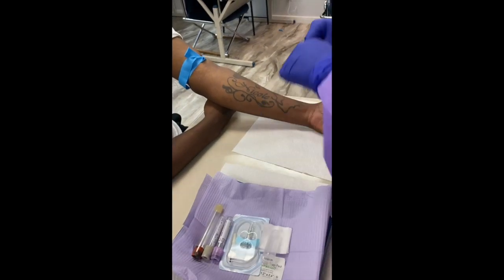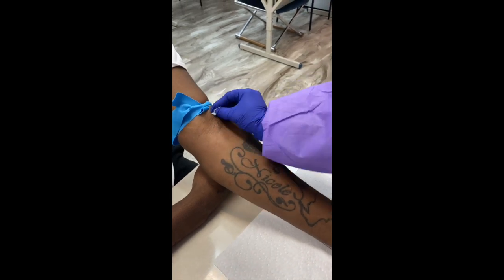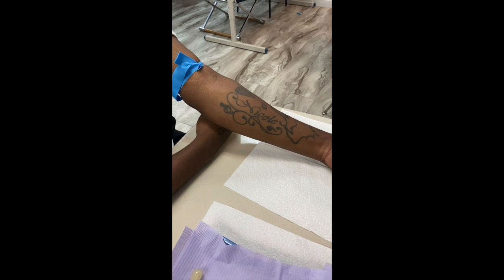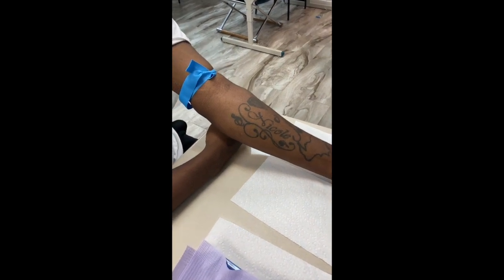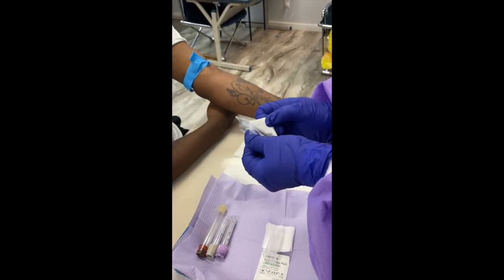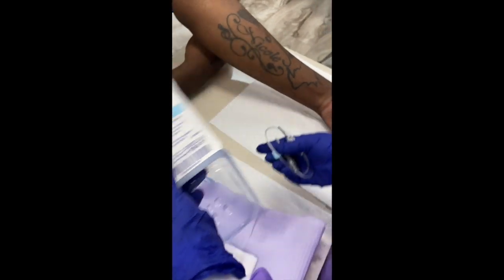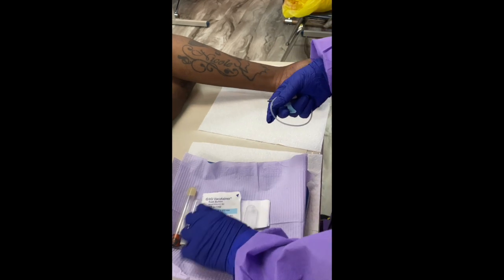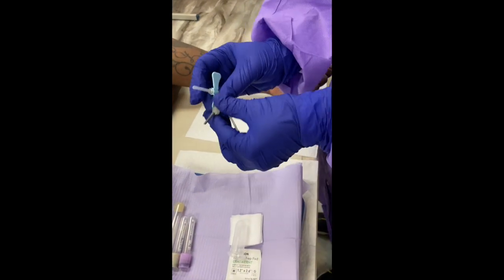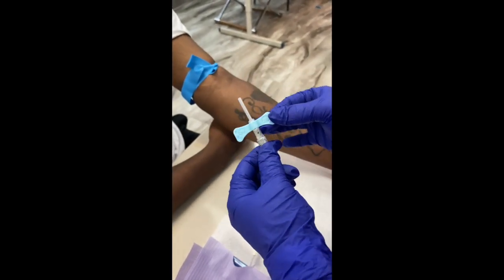Once you identify the vein, the next thing you want to do is get some alcohol and rub in a concentric circle. If the patient needs a second one, go ahead and use another alcohol pad. Always keep your space clean — after you're done with packaging, throw everything in the trash. I'm taking out what's called a butterfly — this is a 23-gauge butterfly. As I palpated on his arm, I know that a 23-gauge is a little too small, but I'm still going to go through the motions to show you what the butterfly is about.